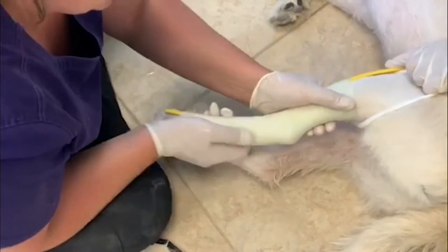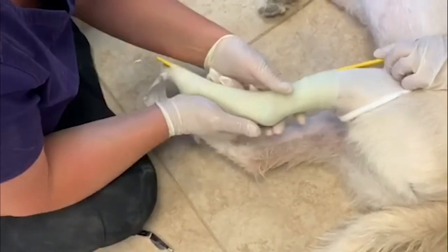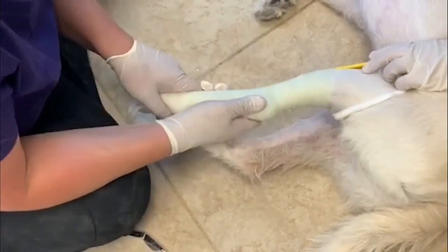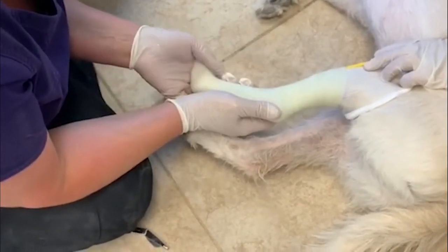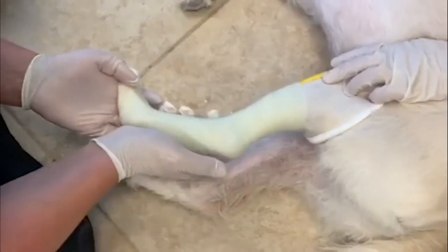You want to mimic a standing position, so a little bend in the hock. You don't want to super hyperextend the hock. Put a natural bend, and you want to flex that paw to mimic that natural standing position.